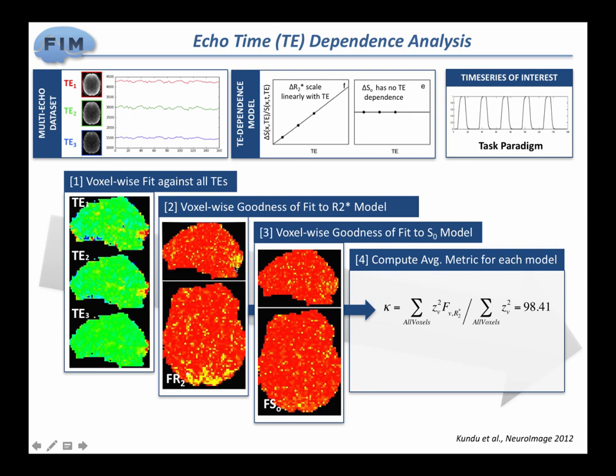Our kappa is going to be how much it behaves like this, how much this seems to be a BOLD-like or good fluctuation. And our rho is going to be an estimate, a single number, that tells me how much it looks like this. So in this particular case, it looks like the kappa is much bigger than the rho, so I would end up saying that most likely this is a fluctuation of BOLD origin. Does that make sense?